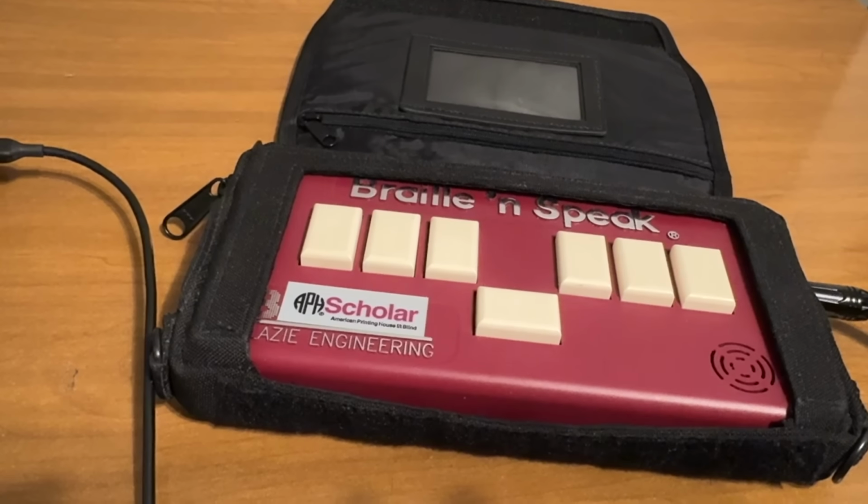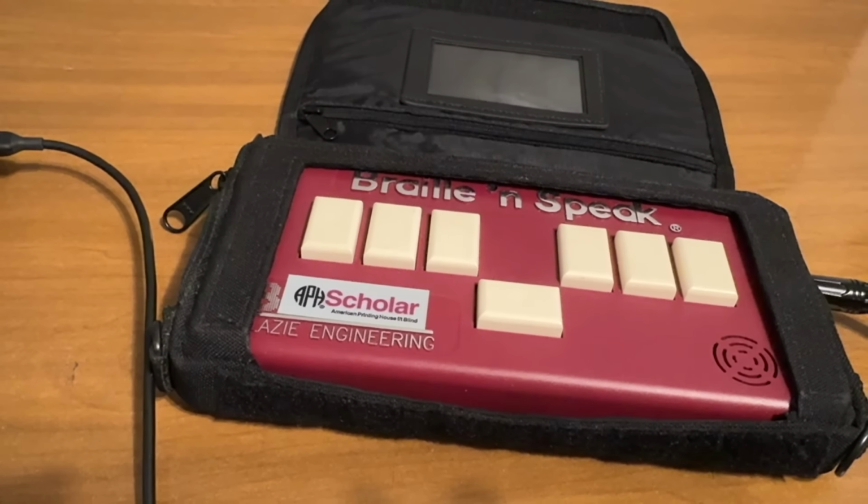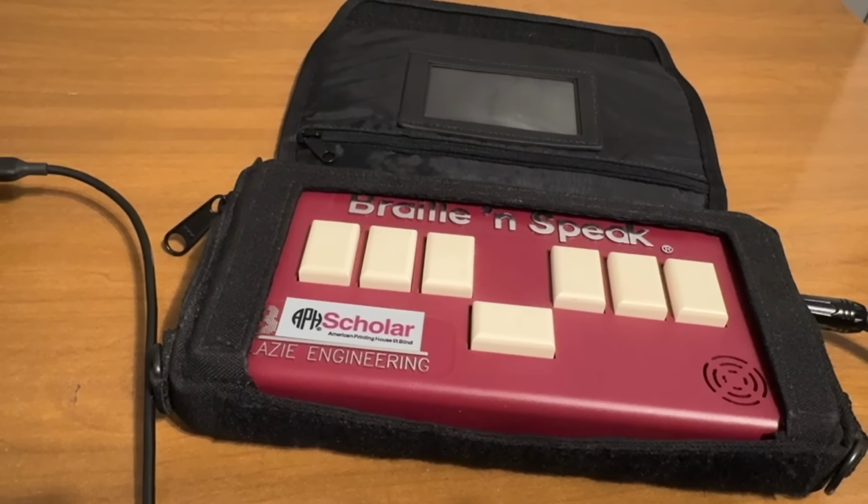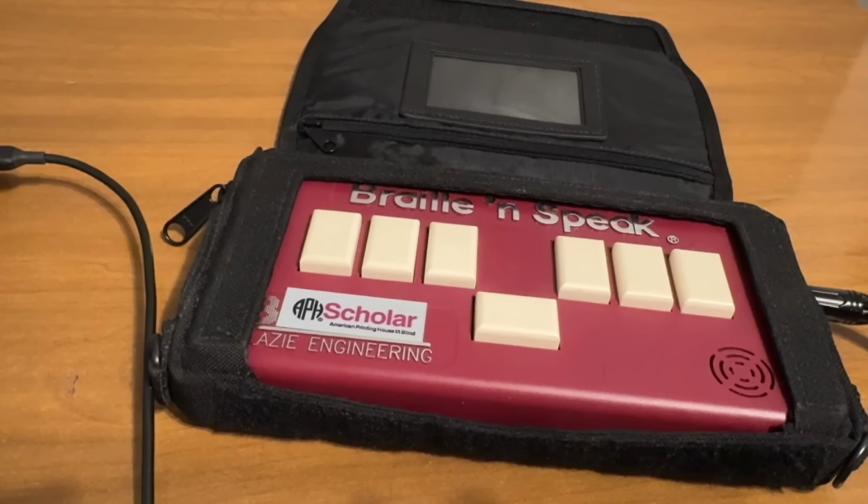Pull-down menus, use cord-4 or the spacebar to move down the menu. Use cord-A to move up the menu. Cord-C repeats the current item. Cord-3-6 gives the hotkey. Cord-E selects the current item.